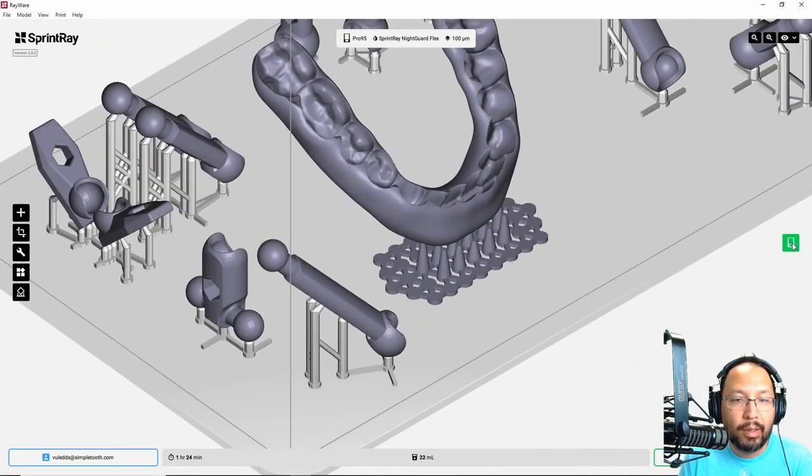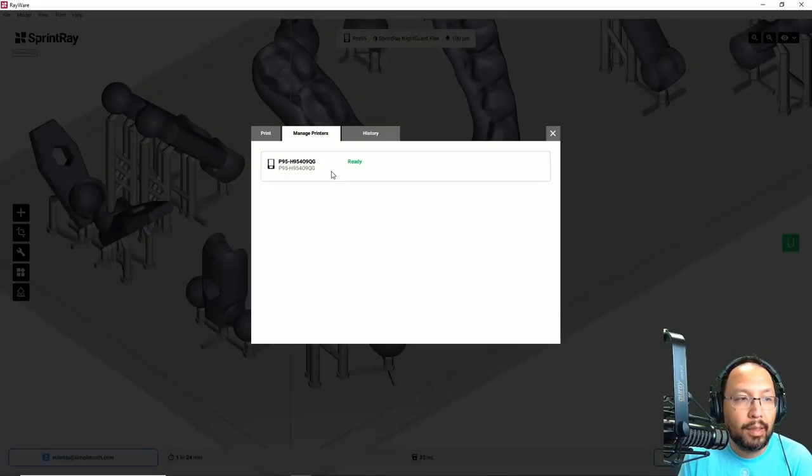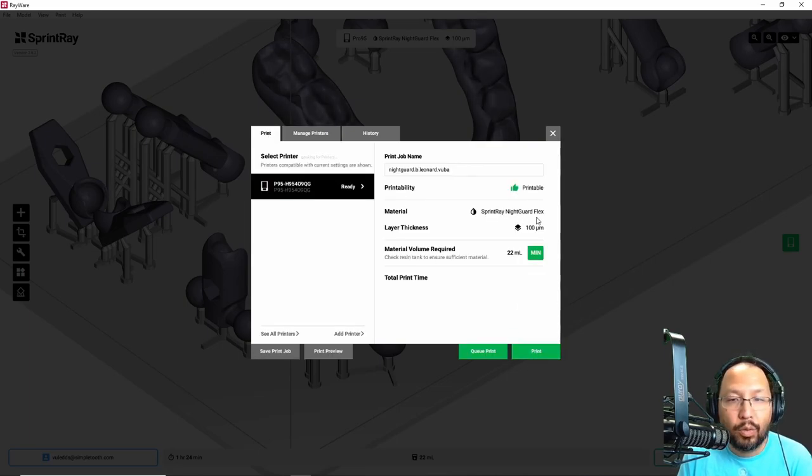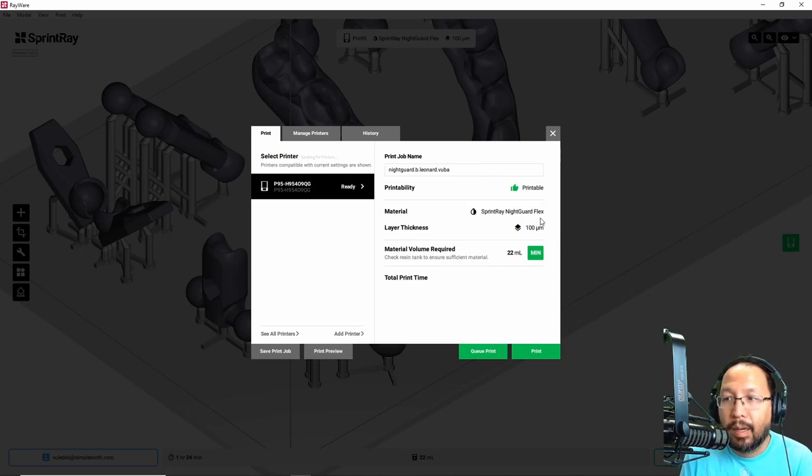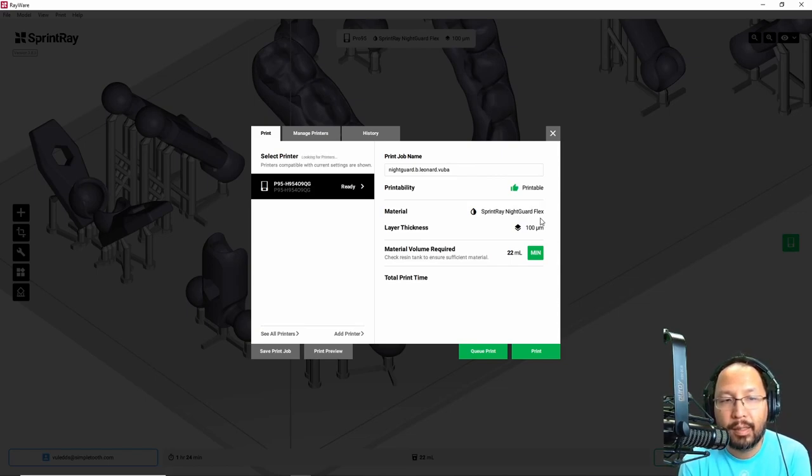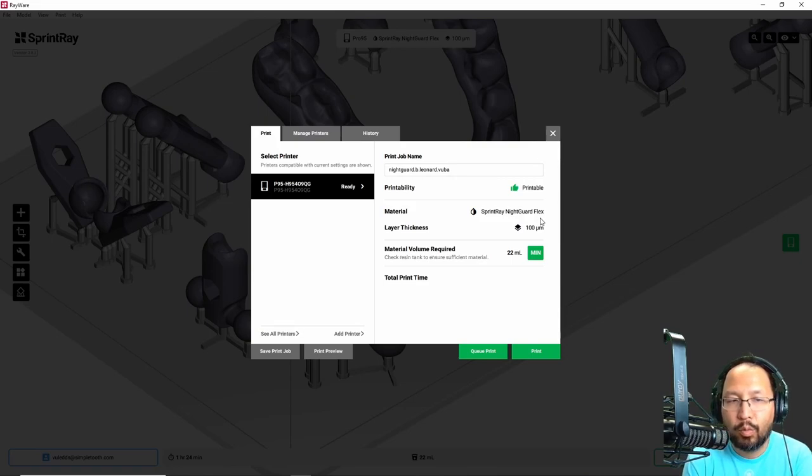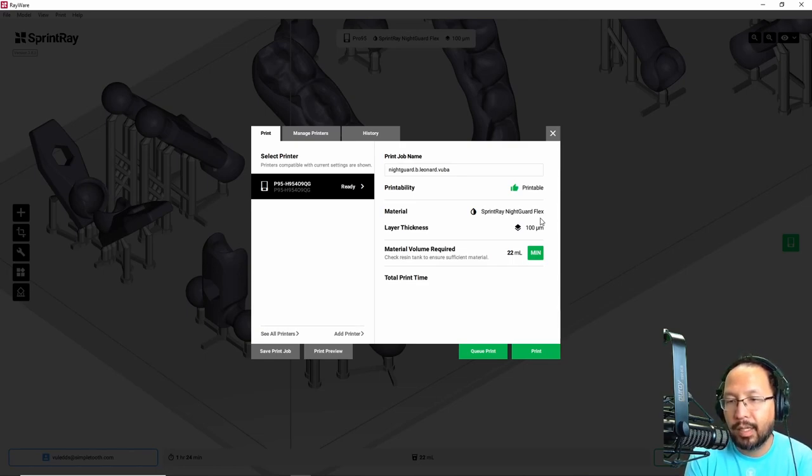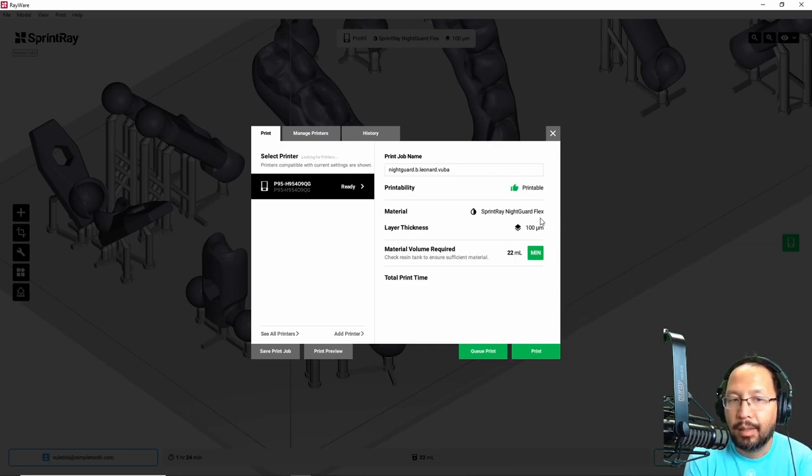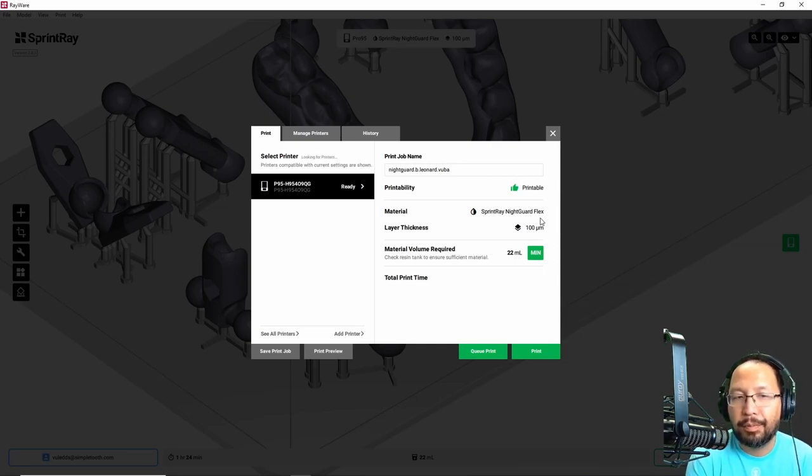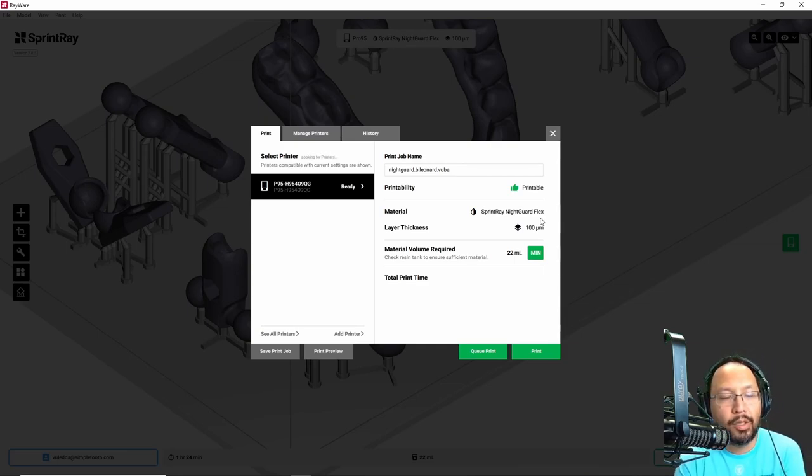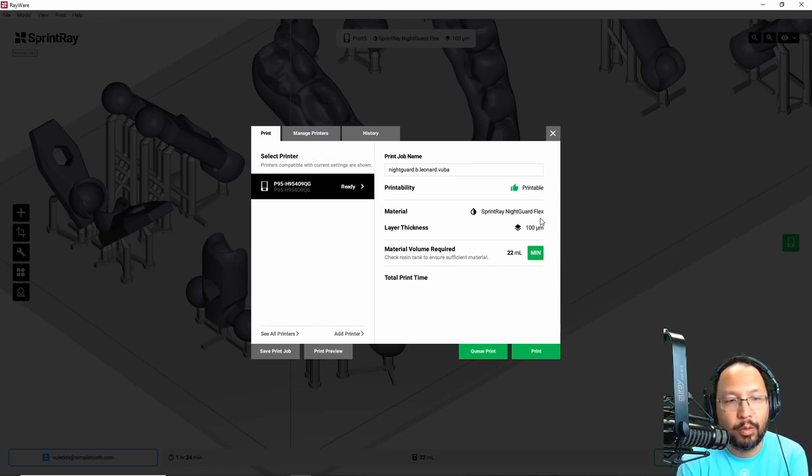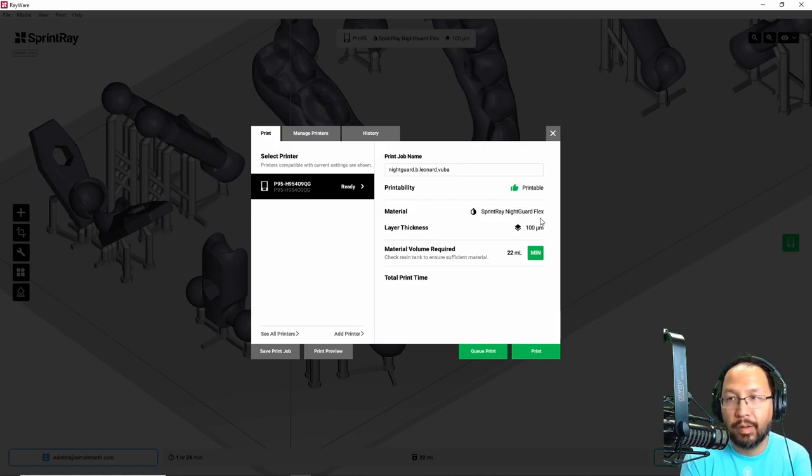I'm going to go ahead and hit this thing, make sure you're on the print tab, make sure that you have the correct resin picked. I've only verified this with Sprint Ray night guard flux. I've tried similar things with Keystone Keysoft Splint. I love the material. It works all day long with VuBase 4, which is the one with just the ball sticking up and not the Crayola spikes here. So I know for sure this VuBase 5 will work with night guard flex. It is a hardier, more resilient material.